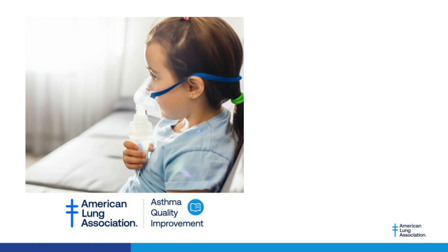So the first of the questions we have is coming from Omaha, Nebraska, and they're asking, if you are in primary care and you usually take the spirometer into the exam room where the patient is at, it could take 2 hours for enough air cycles to go through to safely occupy that room again. Are there other safe measures or things you should do to be able to perform spirometry in primary care that won't take up those exam rooms?